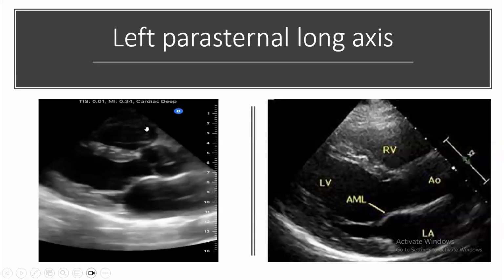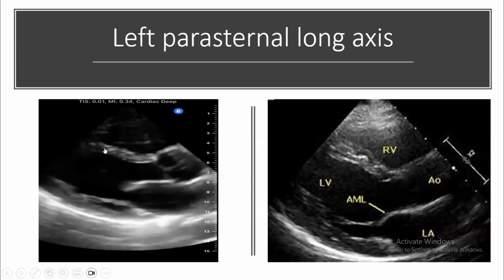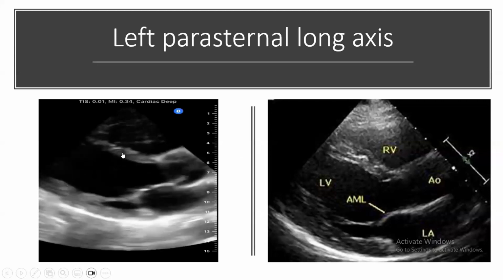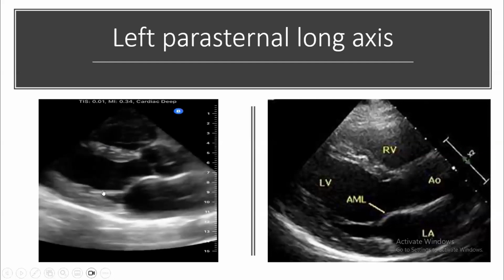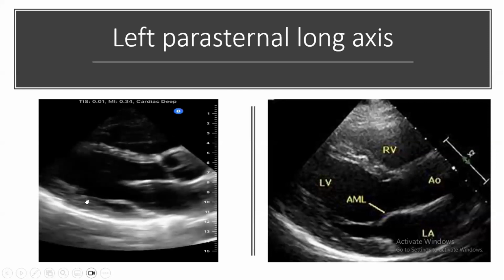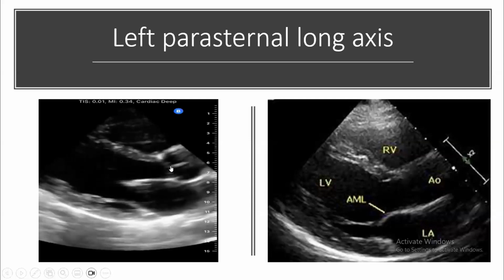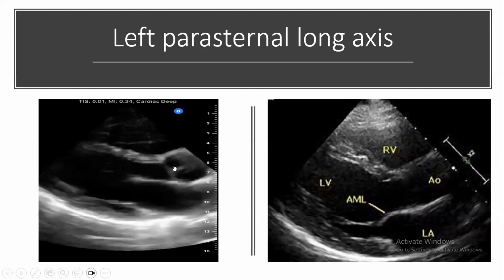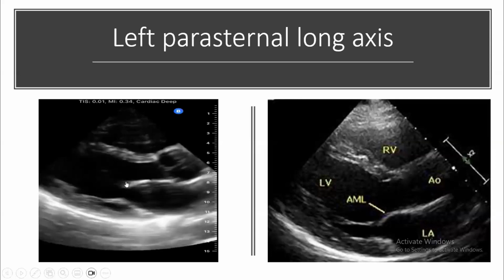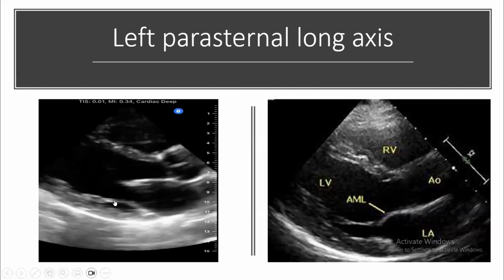We are seeing part of the right ventricle, and it is small. As you can see, the septum during systole is thickening. The myocardium gets thickened here. This is the septum, and this is the posterior wall. The aortic cusps coapt together. There is no calcification; calcification would be shining white, hyperechogenic. And you can see the mitral valve. The mitral valve is free, no vegetation, nothing. This is a normal anterior mitral valve, and this is the posterior mitral valve.